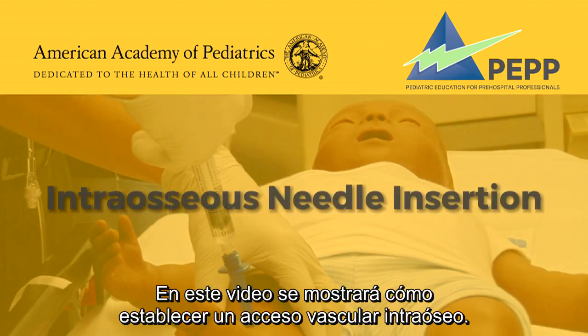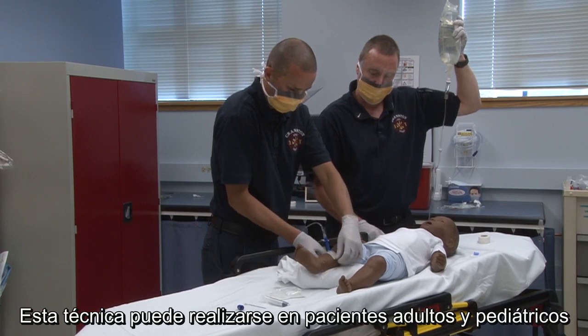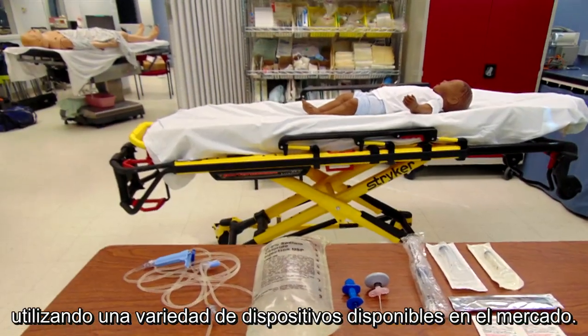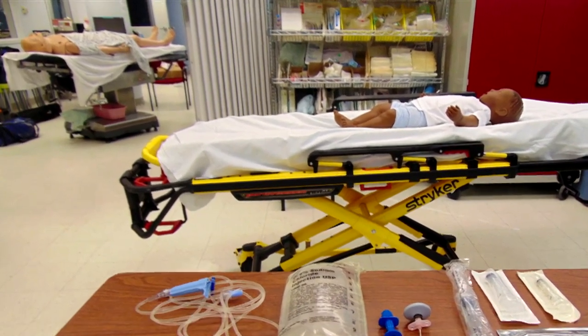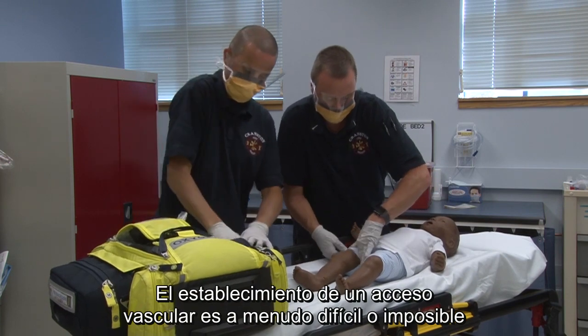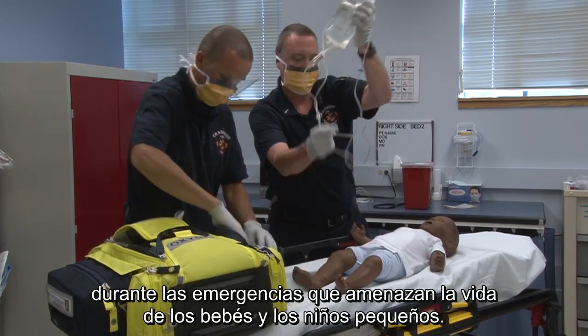This video will demonstrate how to establish intraosseous vascular access. This technique may be performed on both adult and pediatric patients using a variety of commercially available devices. Establishing vascular access is often difficult or impossible during life-threatening emergencies in infants and young children.